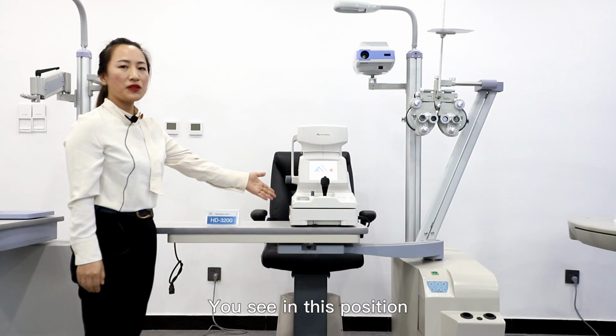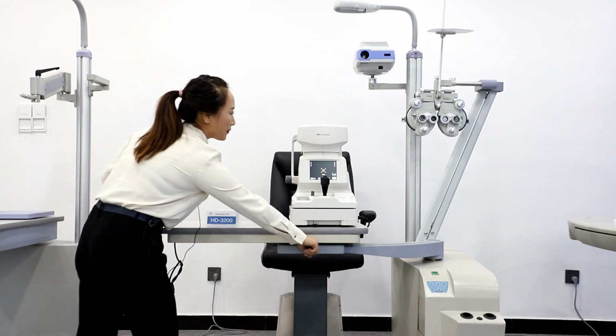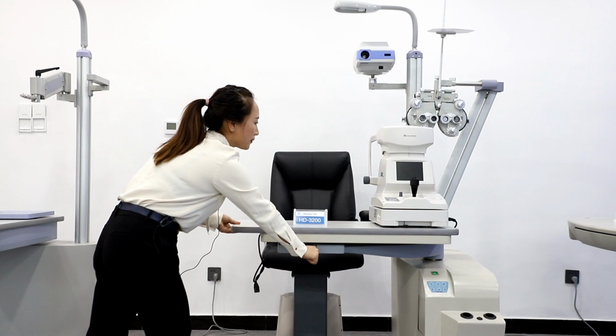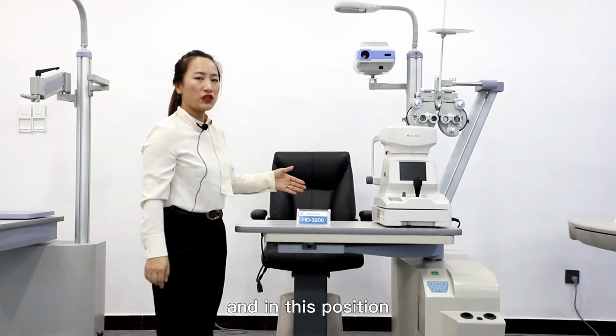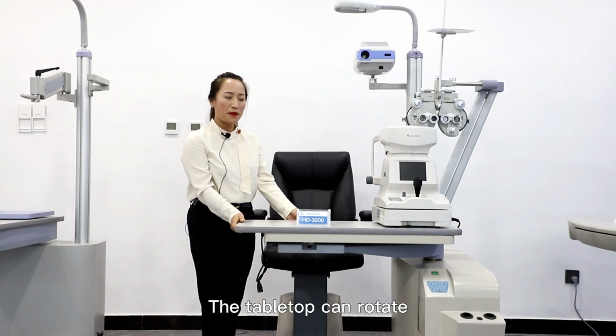You see, in this position, the power is for the auto refractometer. And in this position, the power is for the slit lamp. The tabletop can rotate.